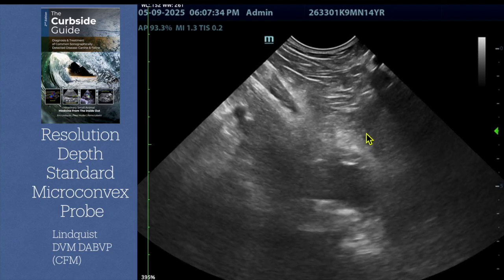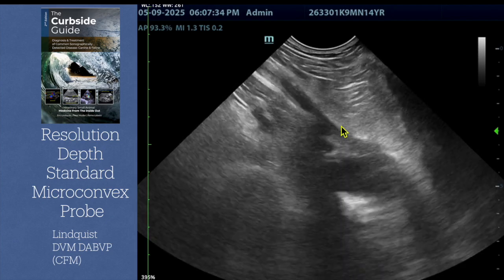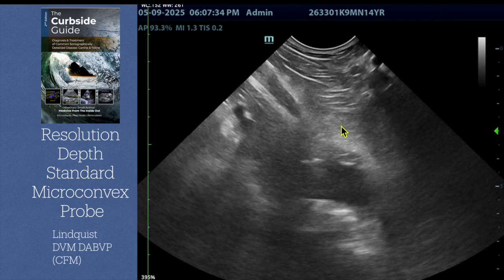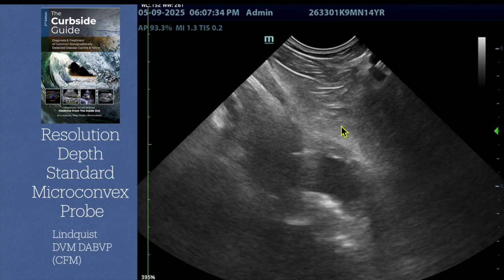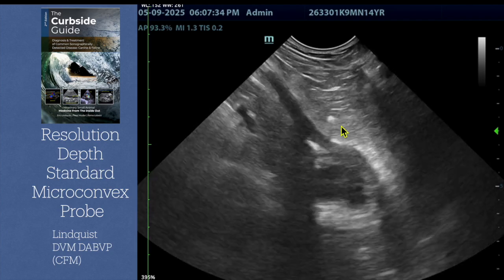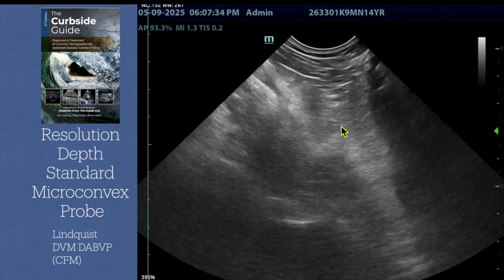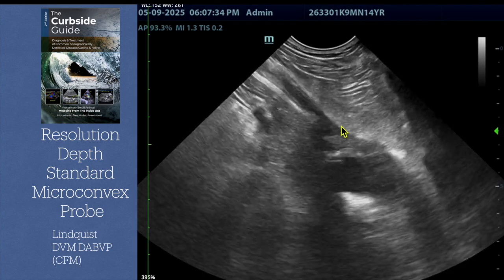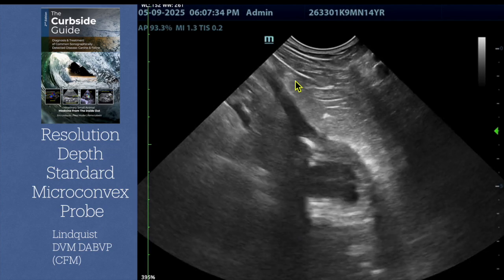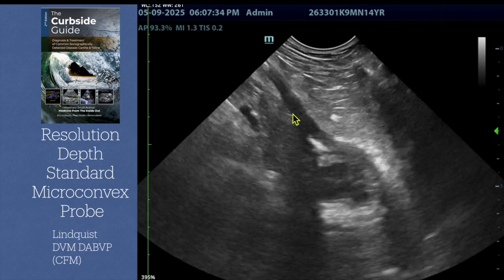This dog is an older dog. Older dogs dry up like raisins, so their acoustic penetration tends to be more difficult than a young dog. So don't go and scan a 6-month-old beagle. Everything's going to scan well with that. You want to do a 16-year-old beagle, and it's trying to penetrate sound beams into a raisin, okay? Because the water content in the older animals dries up, right? And so younger animals have a higher water content in their tissues, and therefore they image better, right? So you want to challenge the machine.